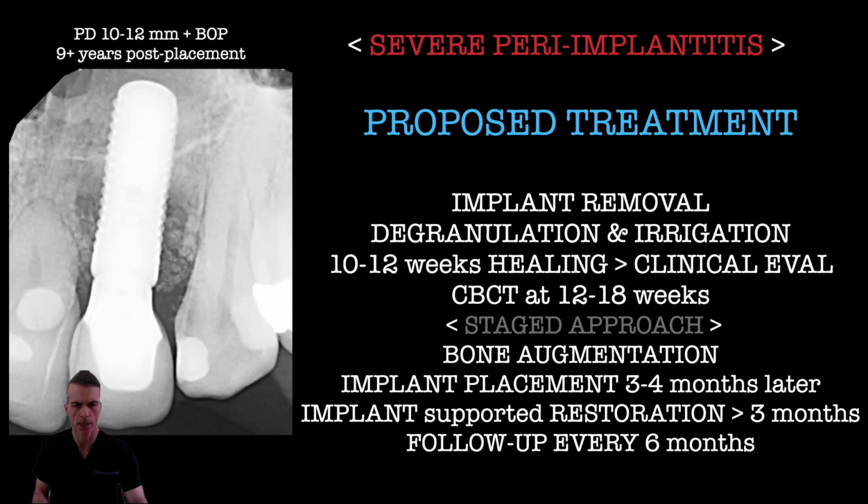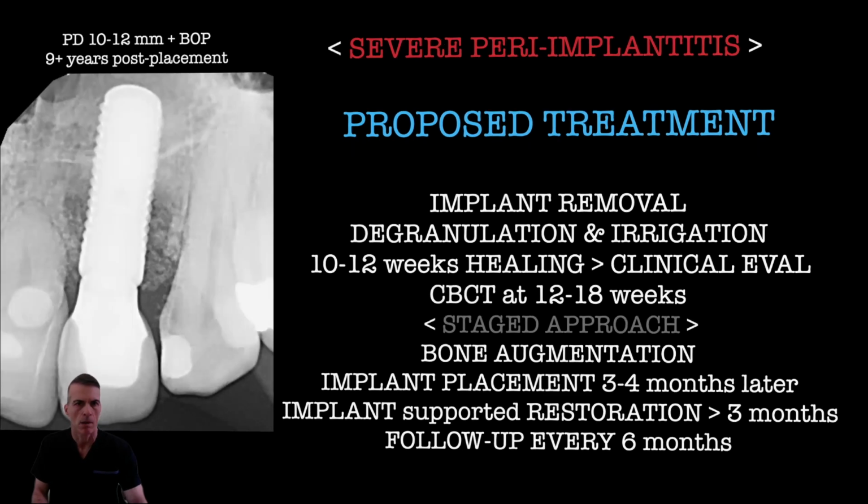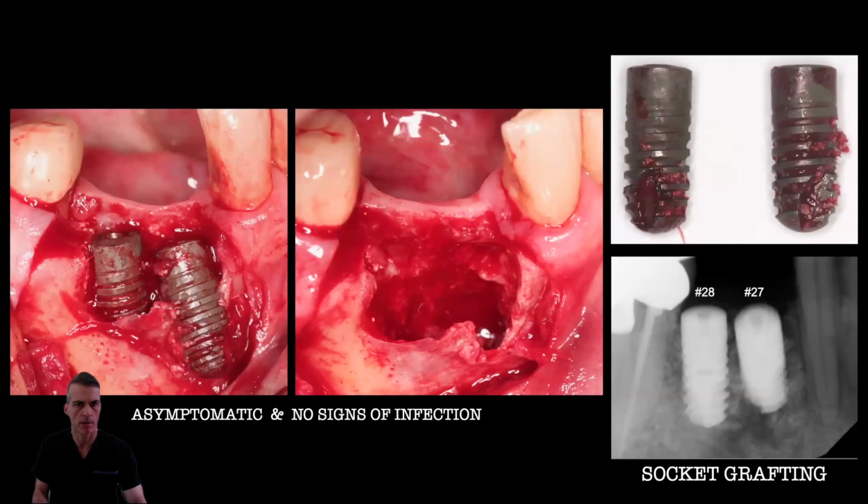And that is, again, the bone augmentation approach. It is something that we'll have to decide according to your philosophy of work. I would definitely advise to do an augmentation protocol using autogenous bone. These cases must be followed up, of course, at least twice a year. And that is key to make sure that there's no signs of inflammation and the implant remains stable with healthy peri-implant tissues.